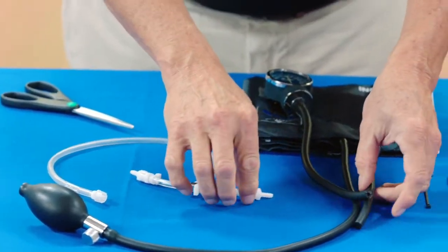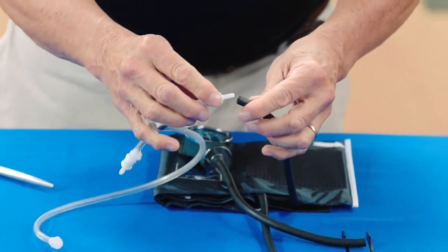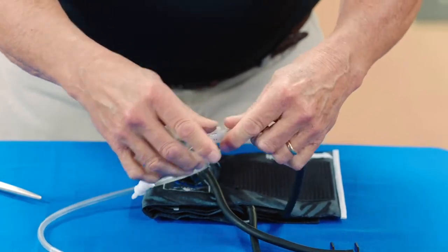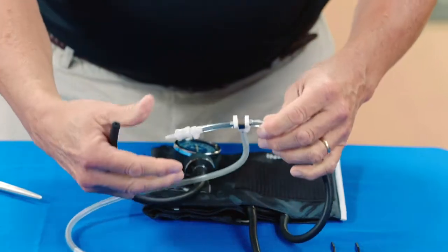For the purpose of this video, we have already cut the tubing. Locate the barbed tubing connectors at the short ends of the T-shaped blood pressure adapter and insert them into the cut ends of the blood pressure cuff tubes.